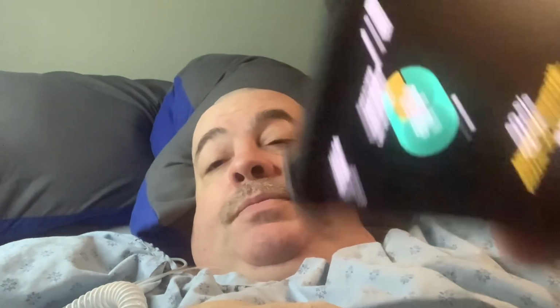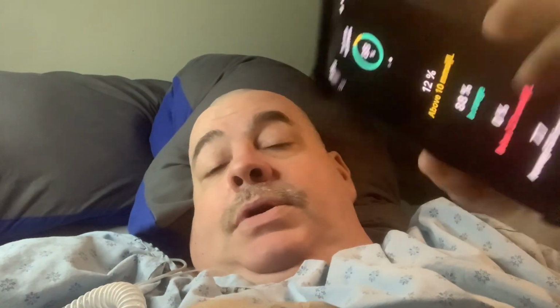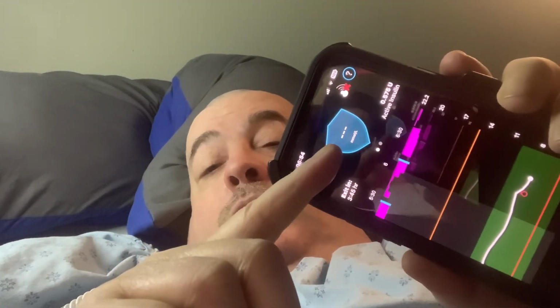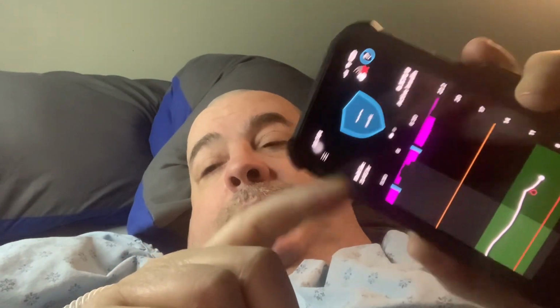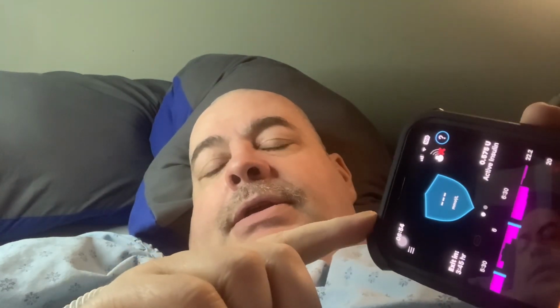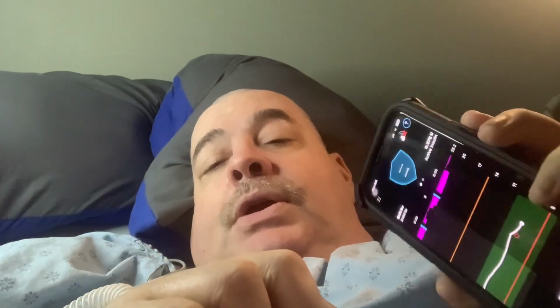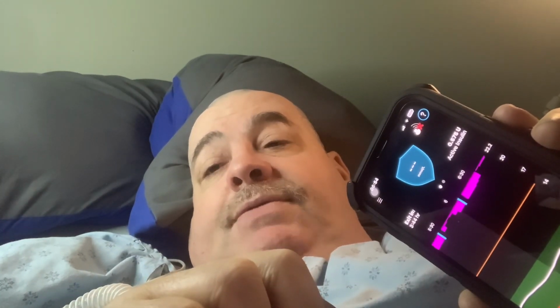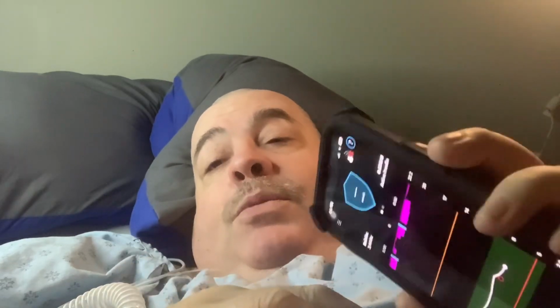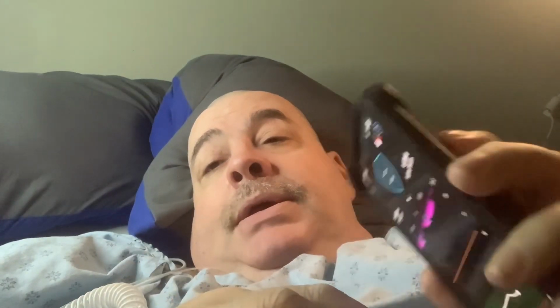In the video so far, we said we don't know what my blood sugar is. But before I did it and did blood sugar, it came out at 7.7. So before you start changing it, if you're relying on this number, it's important that you take your blood sugar before.